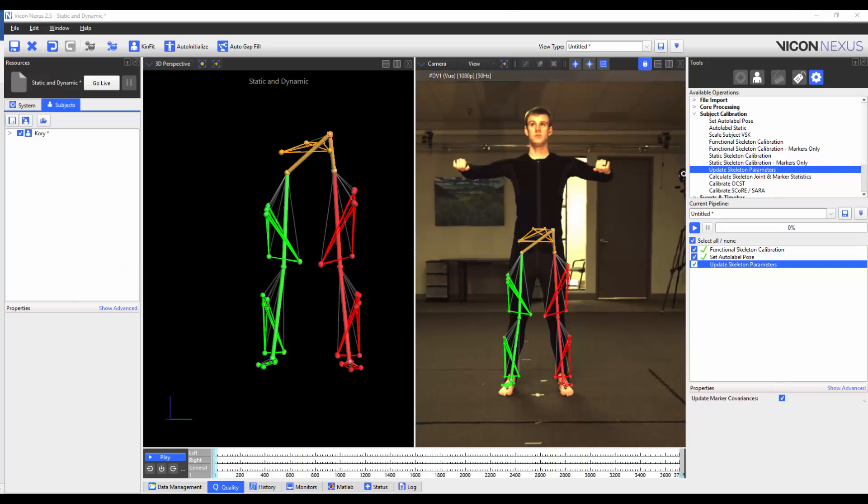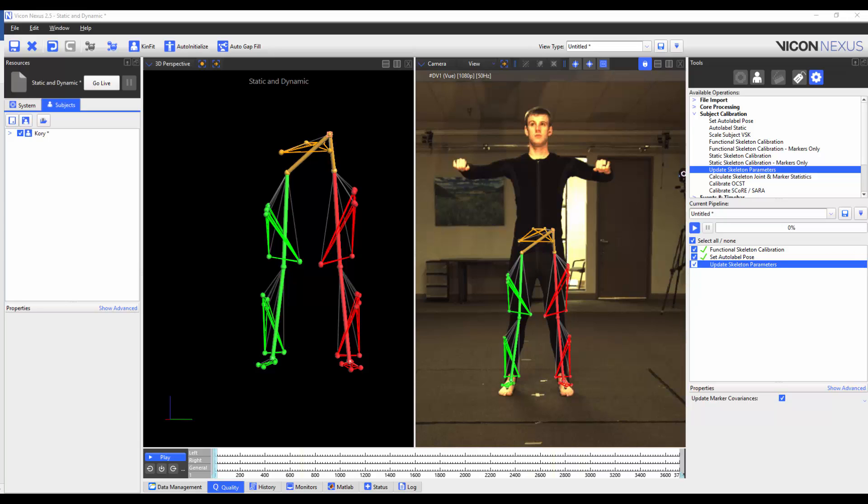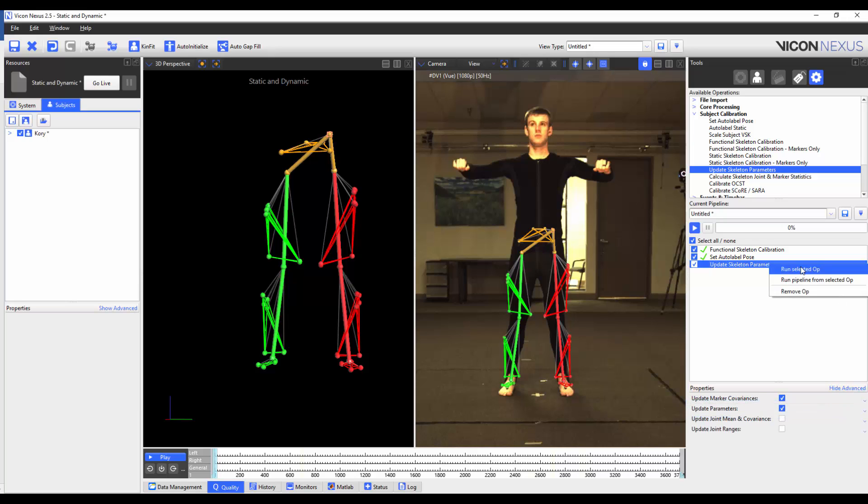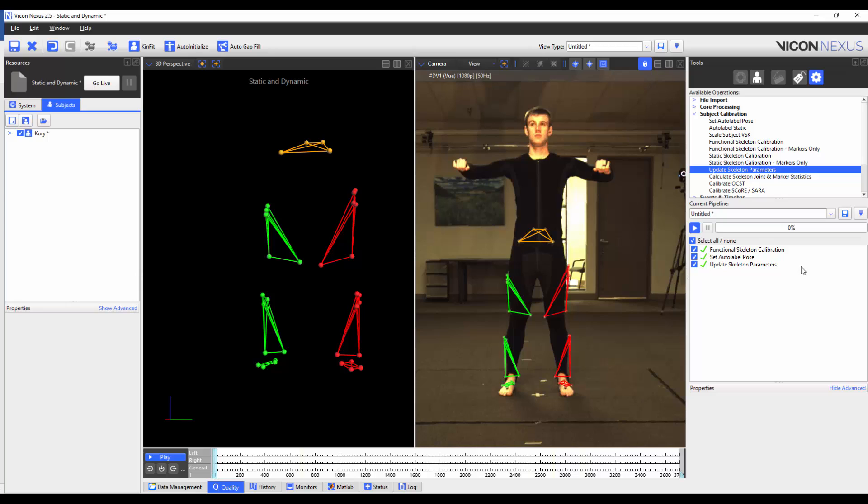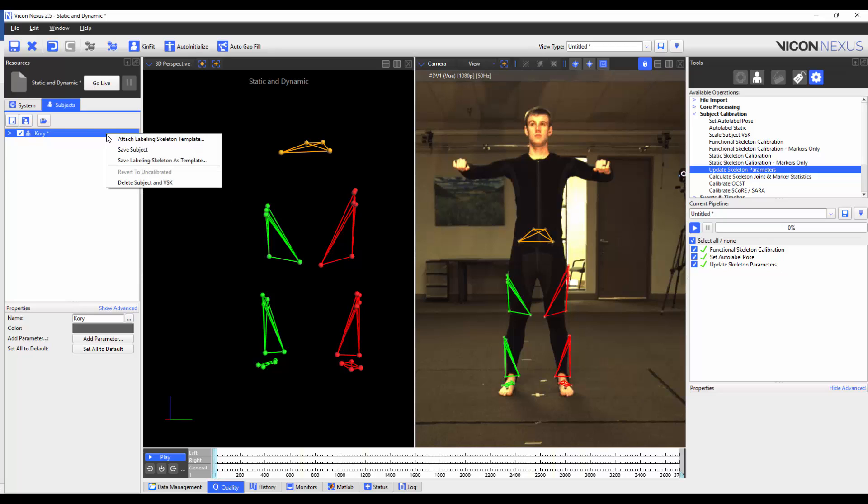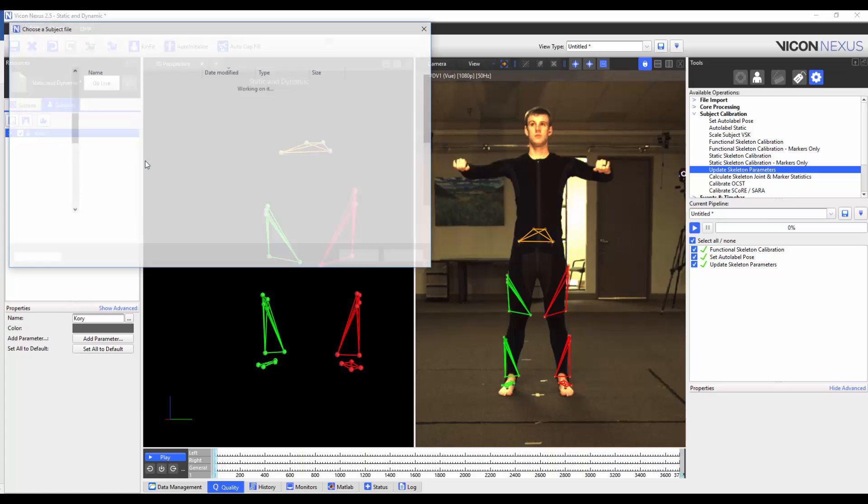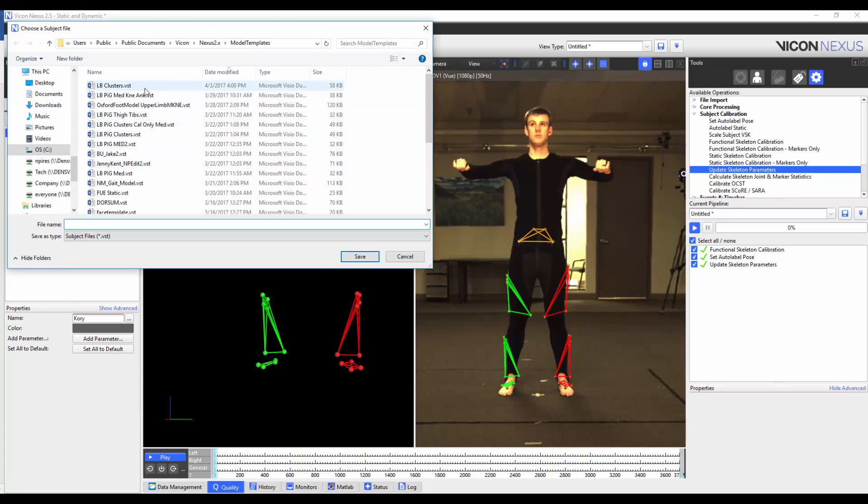Up until now, we have only been optimising the labelling for the subject. To use these joints and marker statistics for the VST, you must update the skeleton parameters and then save. I'm going to run the Update Skeleton Parameters Pipeline operation. Before I do though, I'm going to make sure that the Update Parameters button is checked under the Advanced Properties. I'm now going to overwrite the VST I had previously created by right-clicking on the subject name, saving the labelling skeleton as a template, and overwriting the previous template.